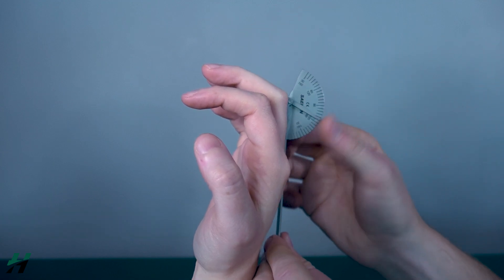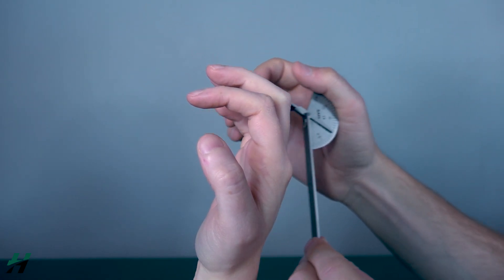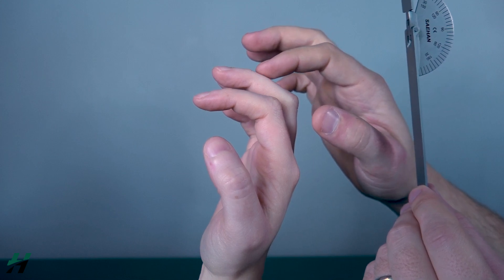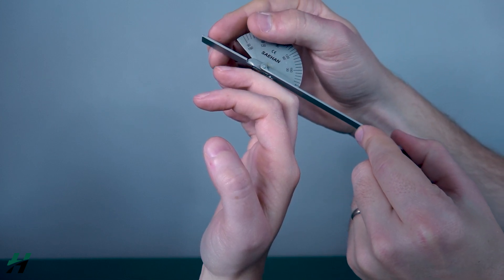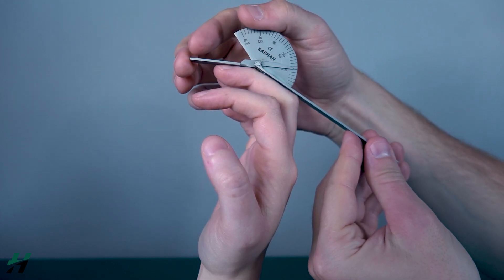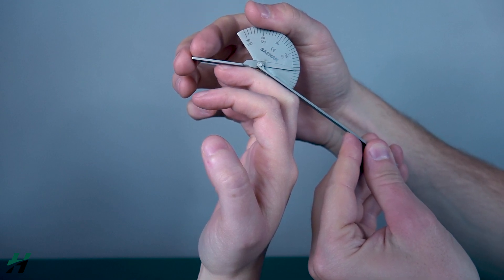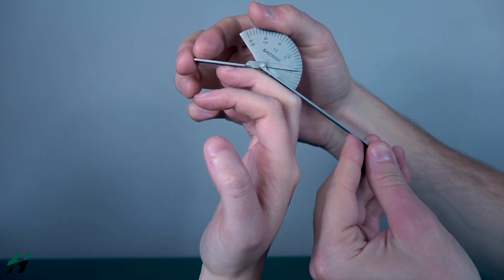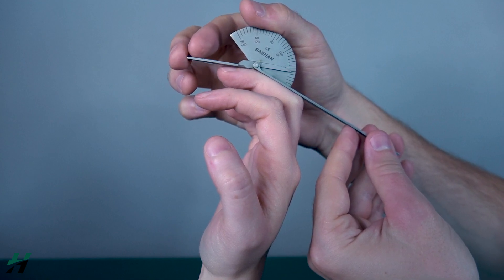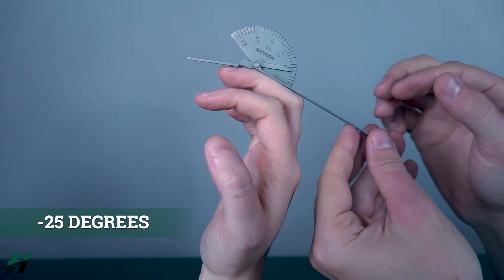You will do that for all of the PIP joints to test for extension. For the DIP, it's the same thing except instead of proximal and middle phalanx, you use the middle and distal phalanx, with the axis on the DIP. She's lacking about 25 degrees of extension there, so that would be considered negative 25 degrees of extension.